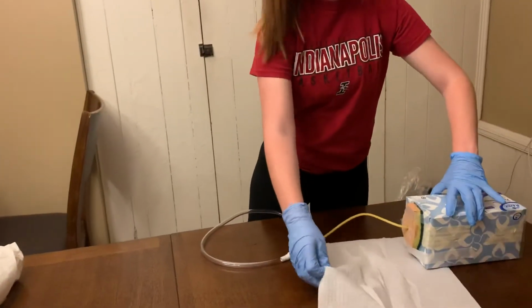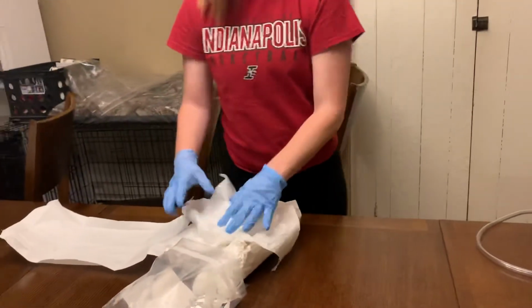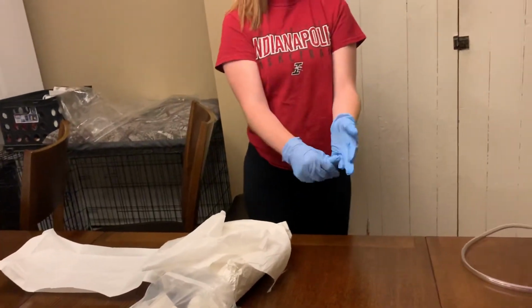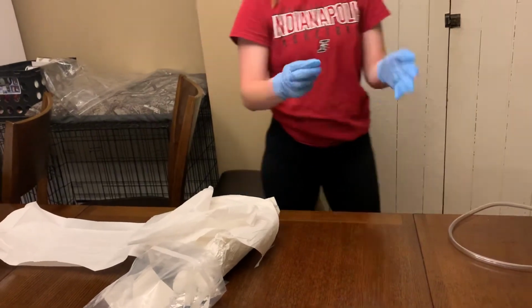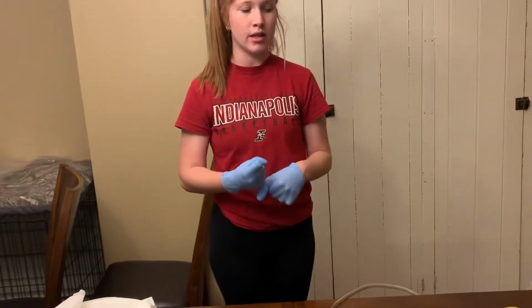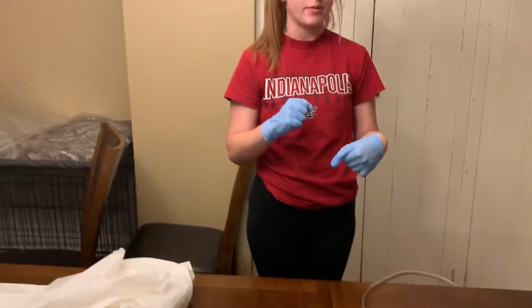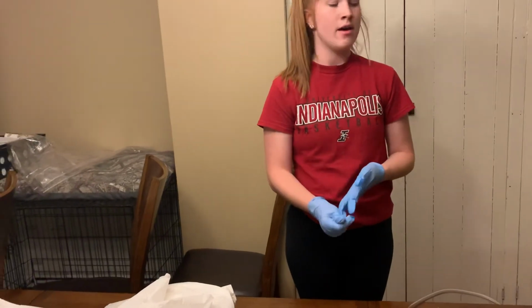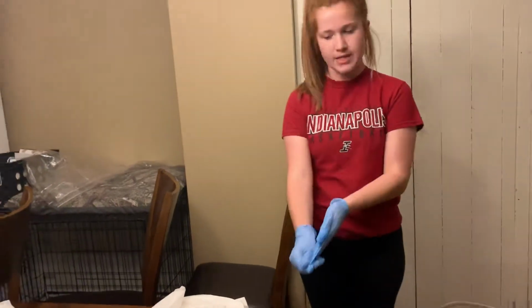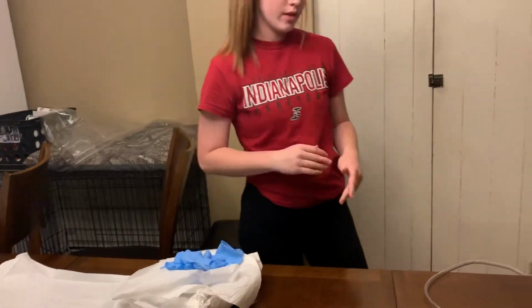I can take this drape out from underneath my patient and discard of my gloves. Actually, before I discard of the supplies and the gloves, I would have to remove any excess antiseptic solution or the lubricant from the perineal area, and then take my gloves off and discard my supplies.